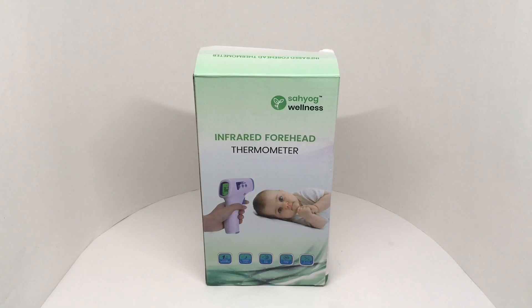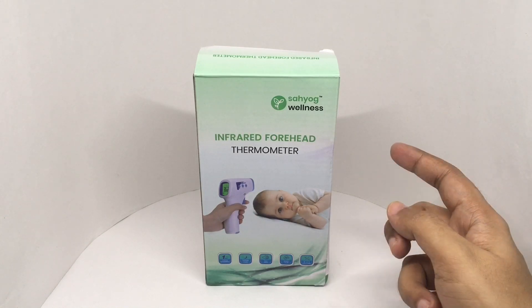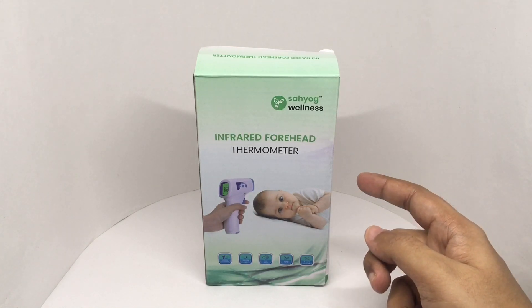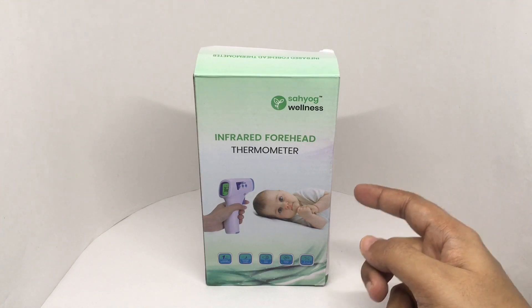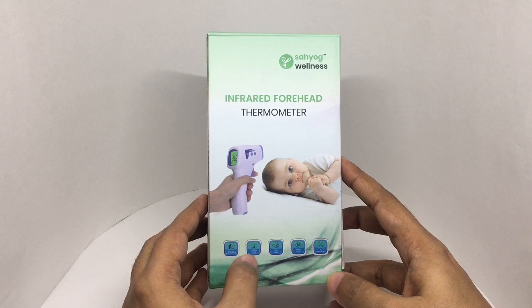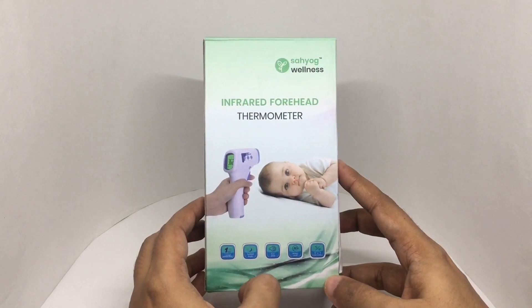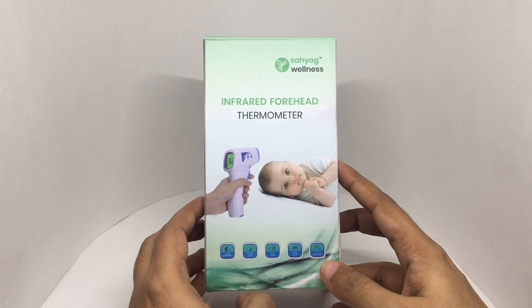Let's take a look at this infrared forehead thermometer from Sahyog Wellness. It costs around 3000 rupees or about 50 dollars. It features one-second measurement, a backlit display, fever alarm, memory recall, and supports both centigrade and Fahrenheit.